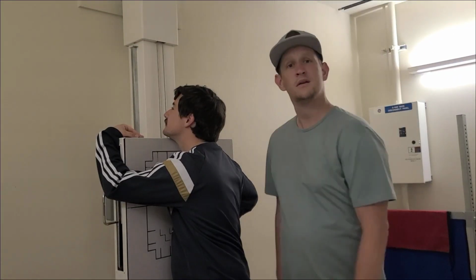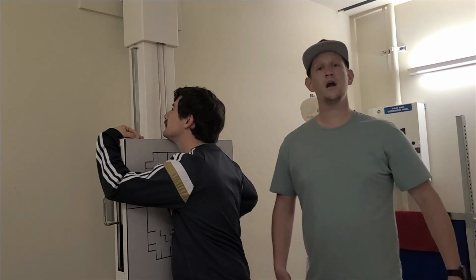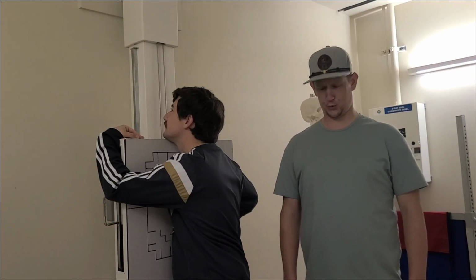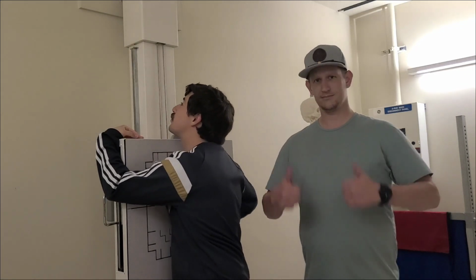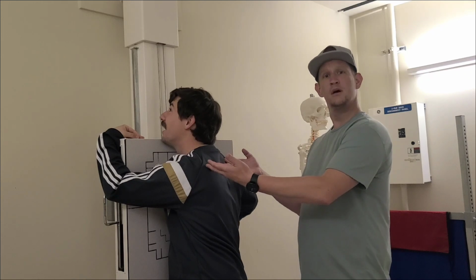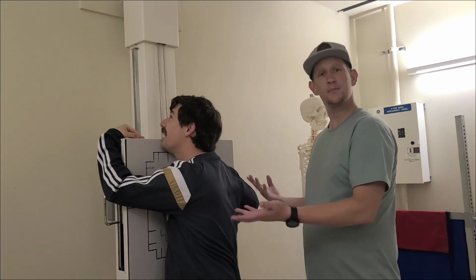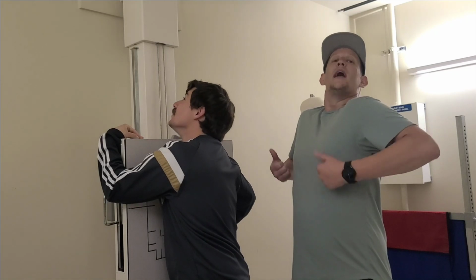Breathing techniques will vary based on where the patient's pain is. Our patient has indicated pain towards their lower ribs, so the most effective method of isolating those ribs will be to take the exposure on full expiration so as to raise the diaphragm above those ribs and out of the area of interest. However, if the patient has indicated upper rib pain, ribs 1 through 8, we'll need to depress the diaphragm by taking our exposure on full inspiration.